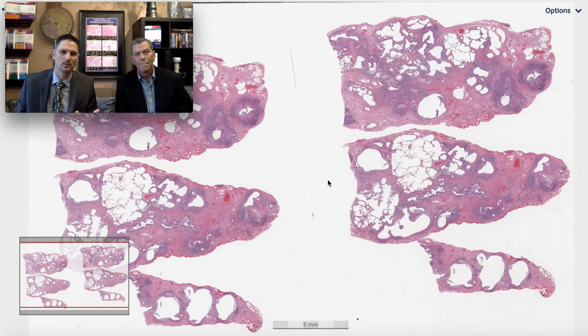And today we're going to look at a case, and we're going to use the poster actually quite a bit today, just to show people how it's actually used in practice. It's kind of a dynamic session. It'll be a dynamic session, like most of them, hopefully.